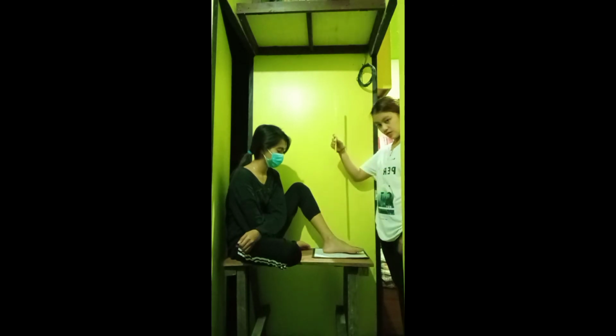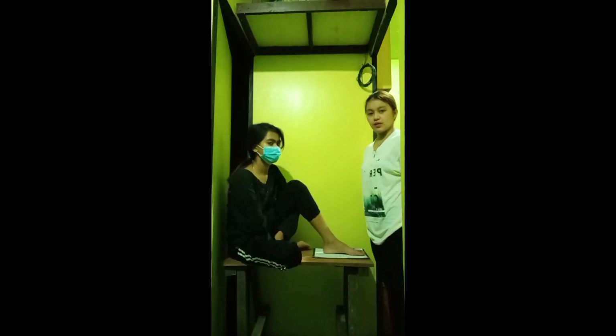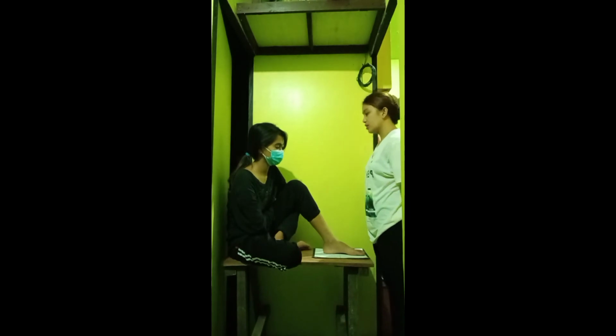Then this is our central ray. It enters at the base of the third metatarsal of the patient. This projection will demonstrate the interspaces between the first and the second metatarsal and the medial and intermediate cuneiform.